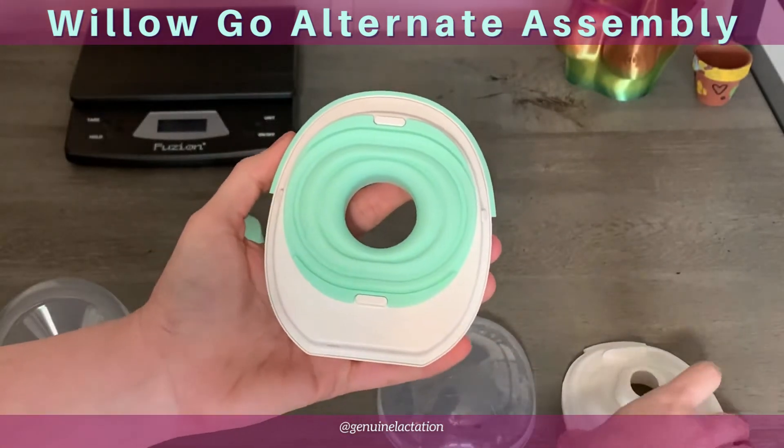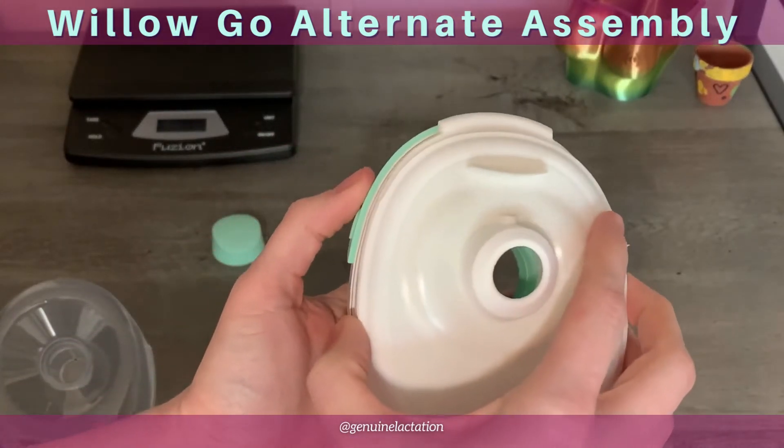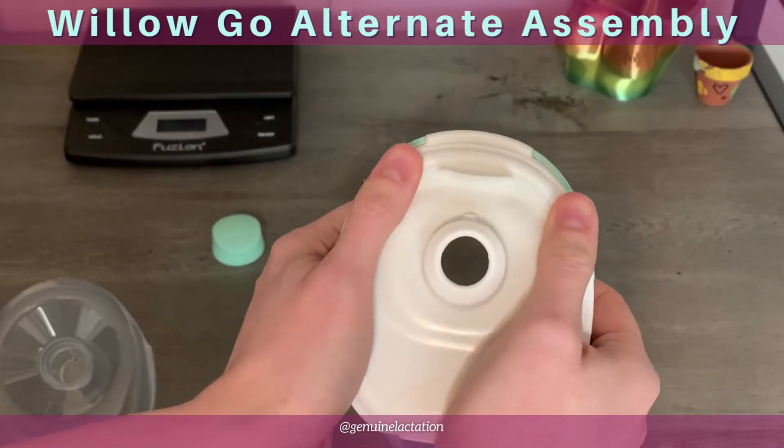Then you're going to place your container back on, pressing it flat to connect both sides at the same time.